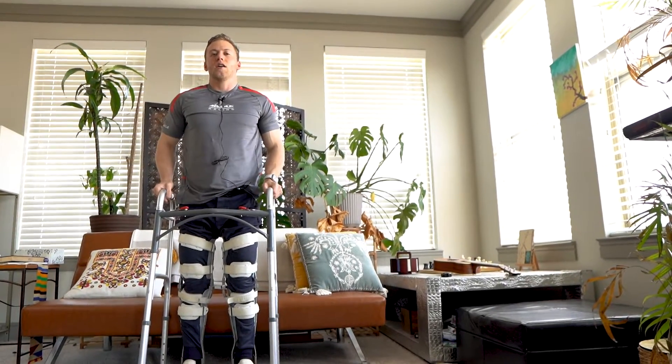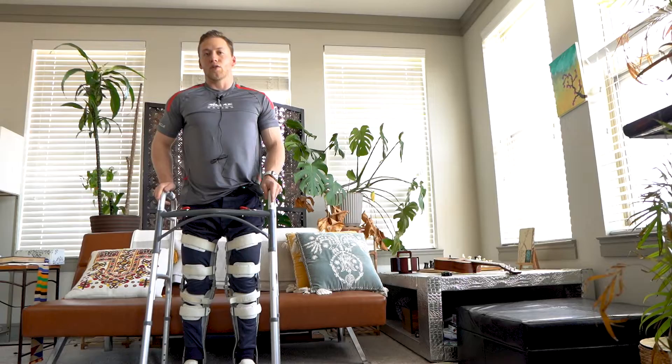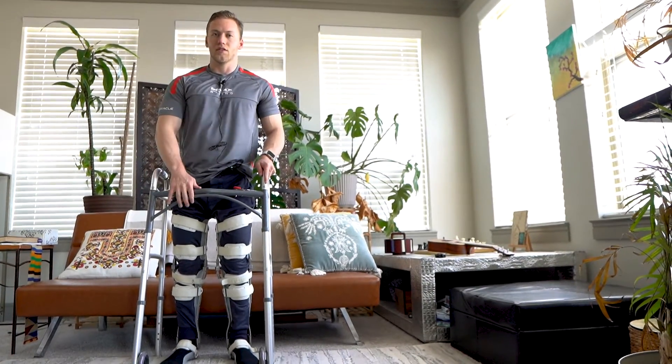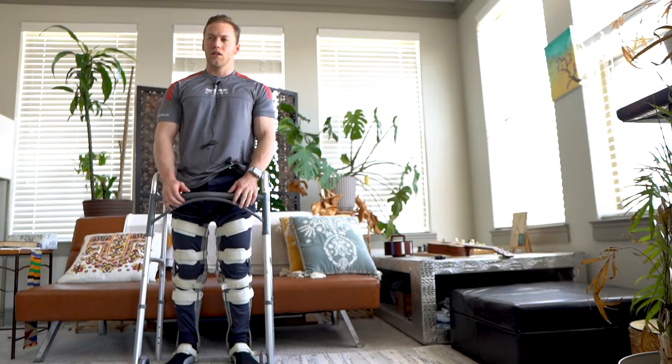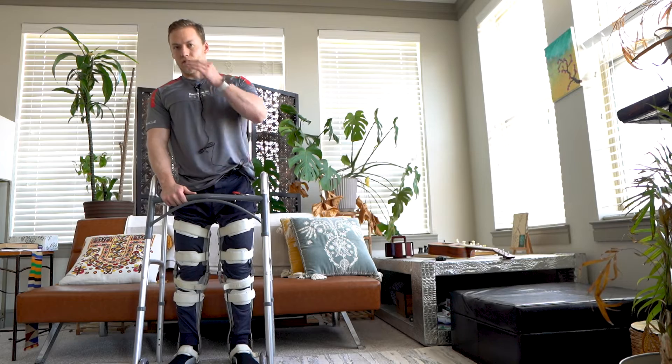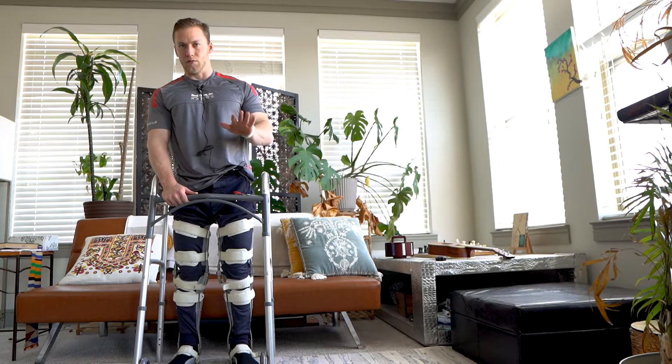I'm not going to lie, that was kind of difficult. The reason it was difficult is because this is a low, minimalist couch. If you're on a bed with a bed frame or something higher, it'll be much easier to stand up from a higher surface.